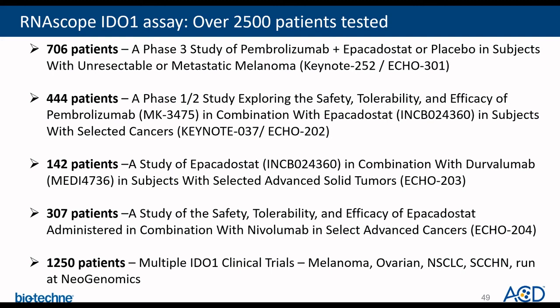And this IDO1 study addresses a frequently asked technical question about how RNA and protein correlate. It showed that RNA and protein correlate well when you have equally sensitive assay for detection of RNA and protein.